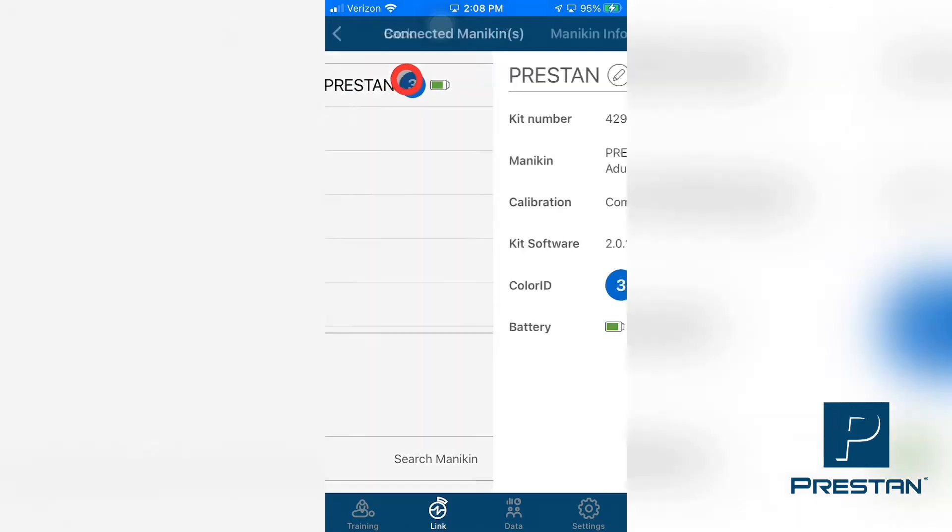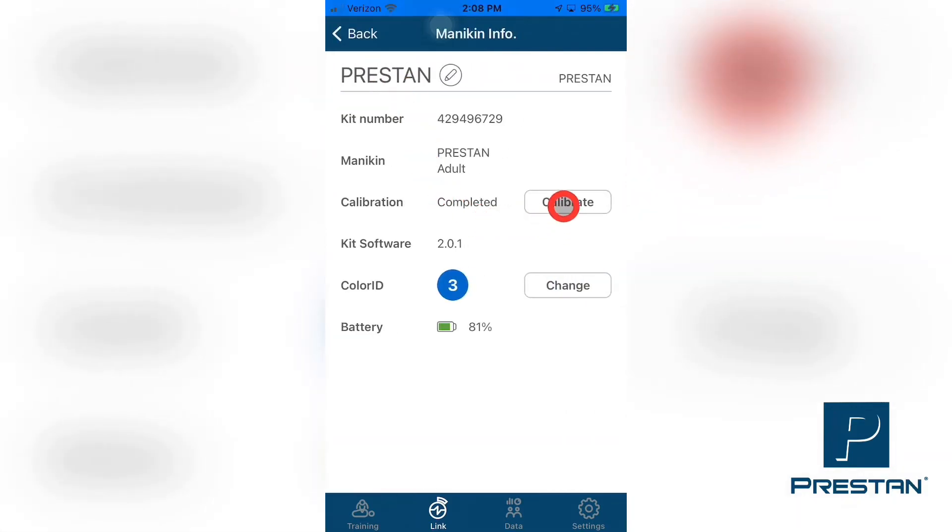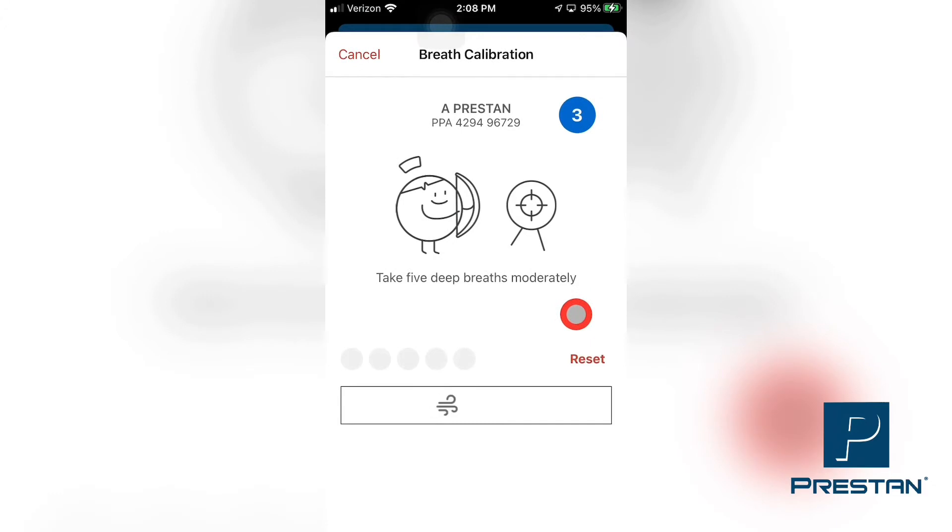Tap Calibrate in the row titled Calibration. Follow the directions on the screen to perform five deep breaths into the mannequin. Make sure that you are properly performing the head tilt procedure to open the airway of the mannequin so that the airway is unobstructed during this procedure.